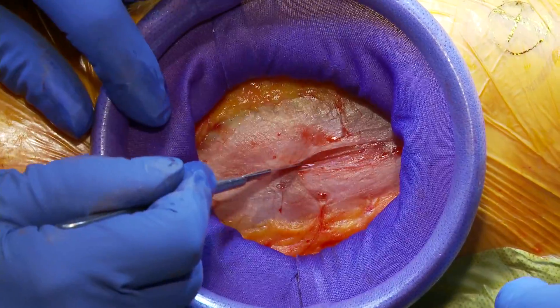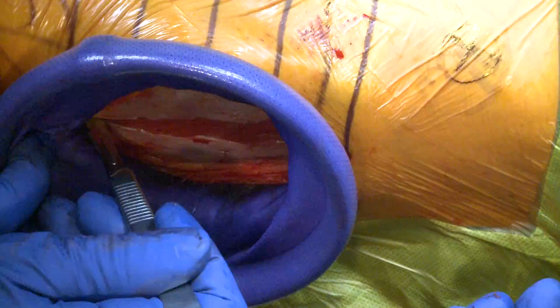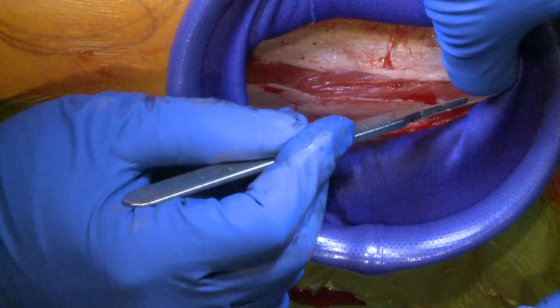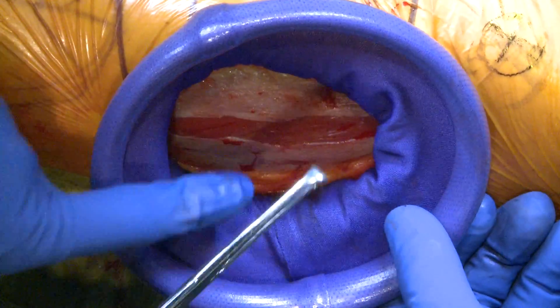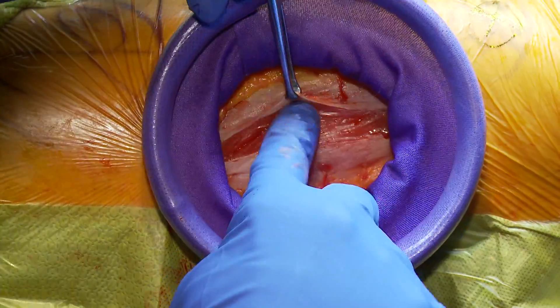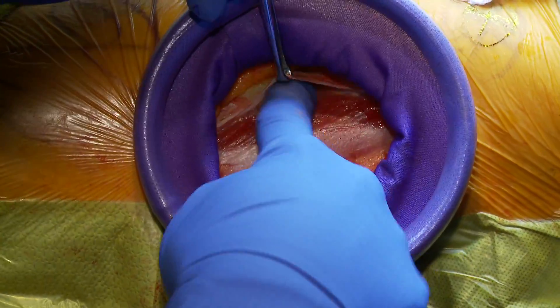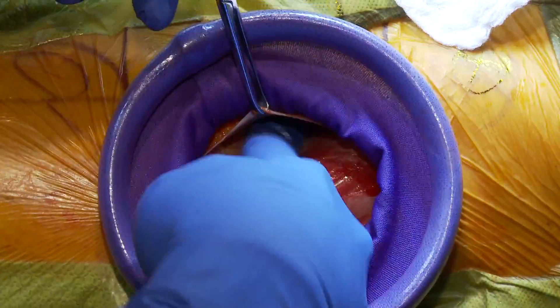I'm going to incise the fascia in line with the muscle fibers — it's always a nice check to make sure I see the fibers in line with what I'd expect with the TFL. We're incising that up and down. That's the tensor fasciae latae muscle, and now we shell it out from inside the fascia — you can see it comes out really nicely.